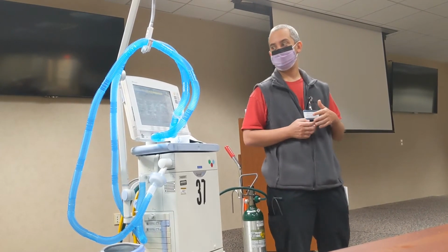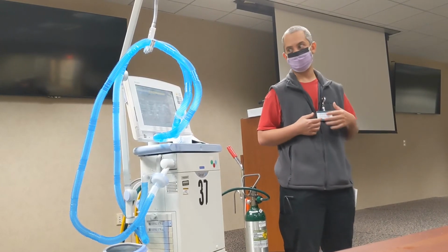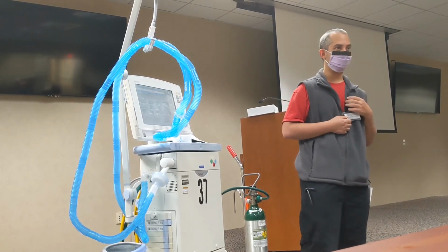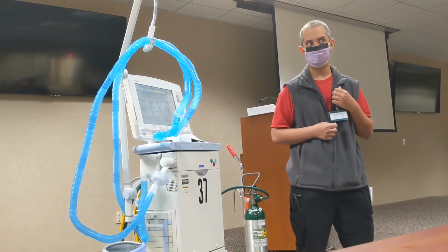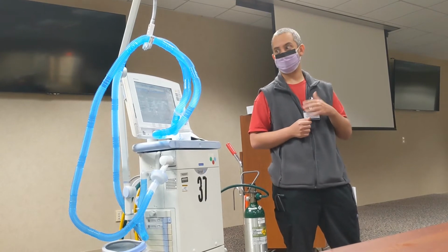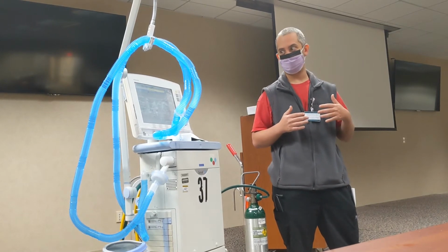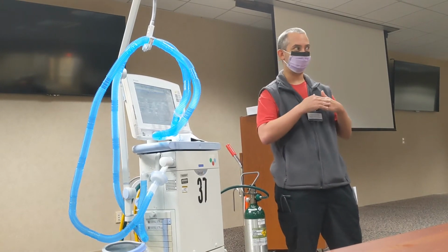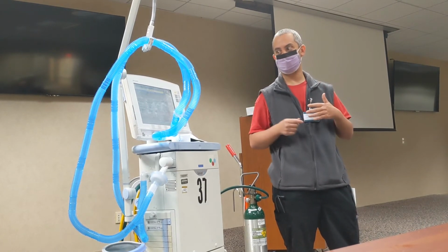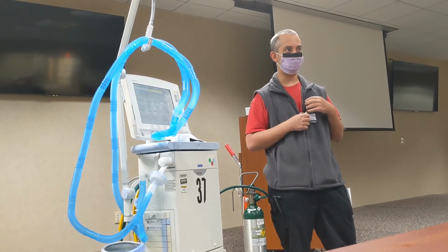And then I know at least some of the doctors, after they get through that acute portion, get the hypoxia under better control, you're getting down to 50 or 60% FiO2, they'll just switch modes altogether and put them back in a control mode. But really one of the beauties of APRV is that you can actually wean from that. So like I mentioned, it becomes almost CPAP basically. And you can give them some pressure support above P high, and then they can start taking their volumes on their own.